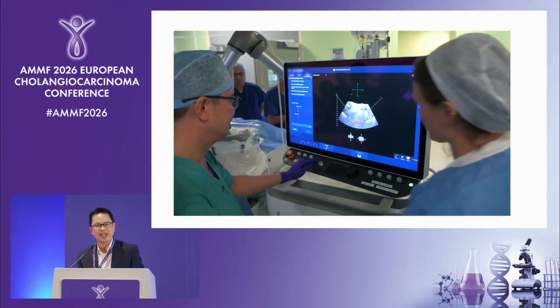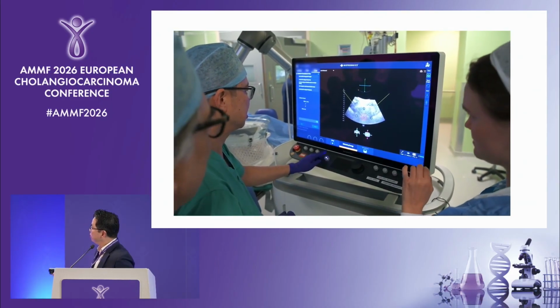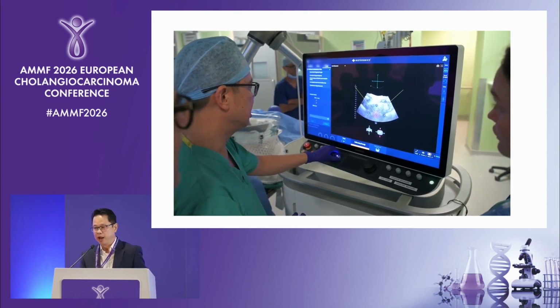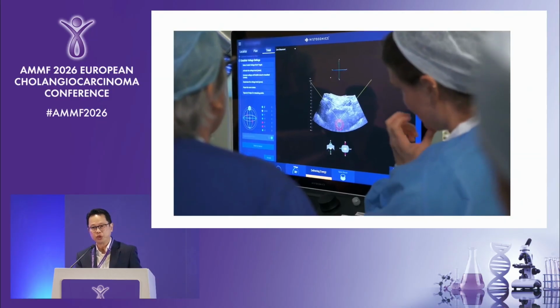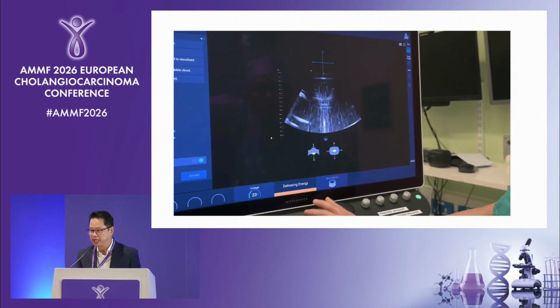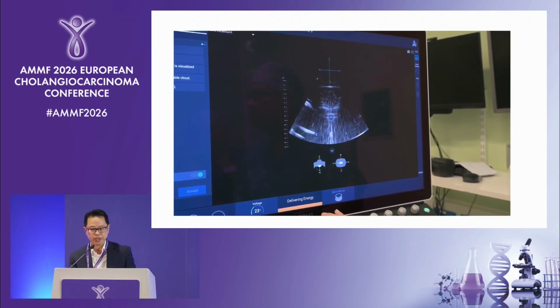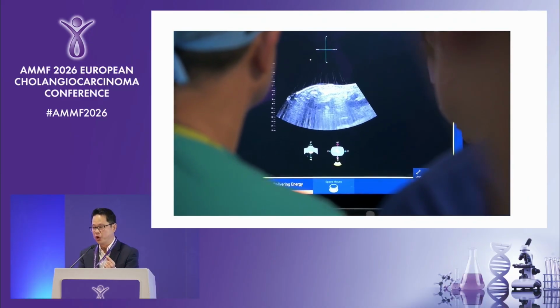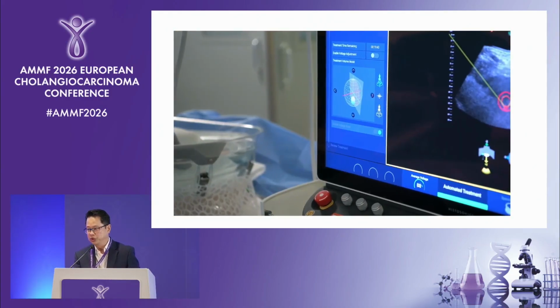Sorry, we were a little bit excited there. That was our first patient, and that was me pressing the on button here, essentially to apply voltage. And once the voltage reaches a certain threshold, the ultrasound energy will be delivered, and you will hear the hissing sound as well as see the microbubbles forming. So that microbubbles, as I said to you, is going to move around that treatment zone. For example, if it's a 3 centimeter volume, then it will continue to treat that area.